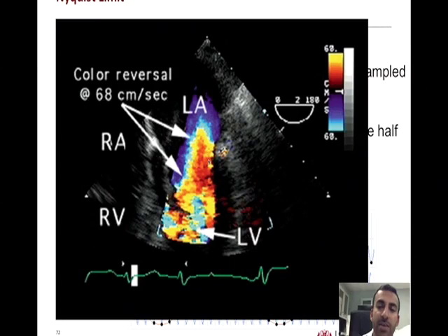So as you can tell, simply because it starts off as a red color, shown here at the lower ranges, and then builds up to yellow, which here is designated as the highest range of velocities in this Nyquist limit. So we see this red building up to yellow, and then all of a sudden we see a blue color showing the same magnitude, but now showing a different direction of flow. Do we think actually that the flow pattern changed there?